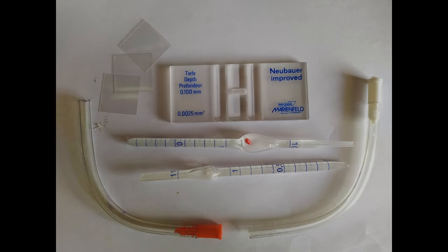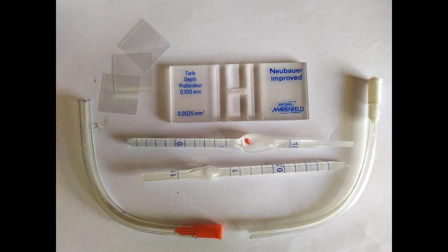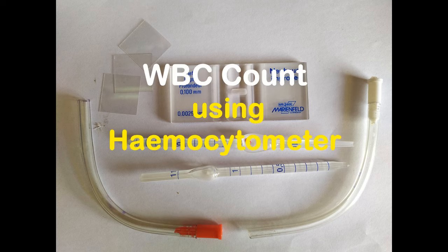In a previous video we talked about the components of a hemocytometer and what it's used for. In this video we're going to count the number of white blood cells in a sample of human blood using the hemocytometer.